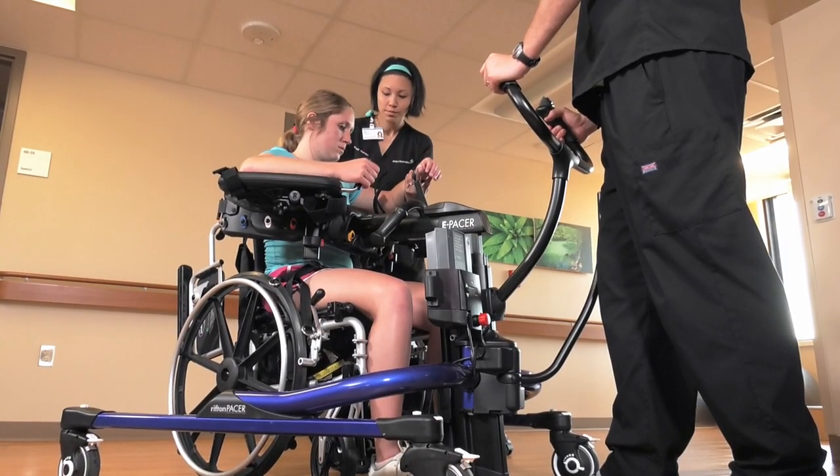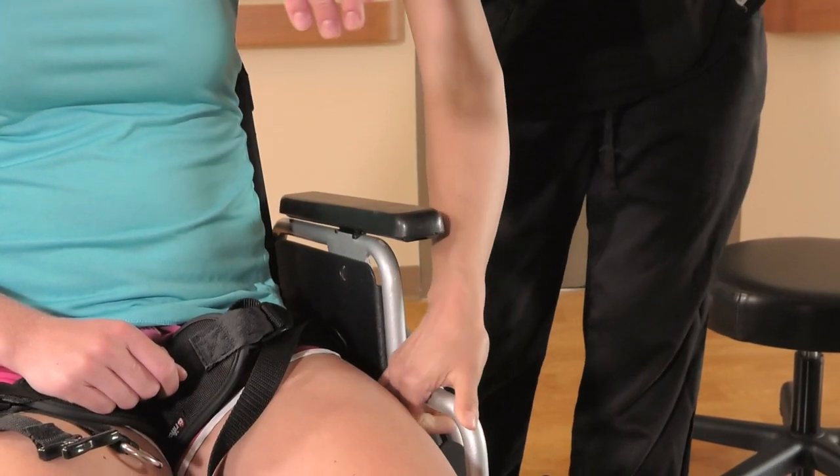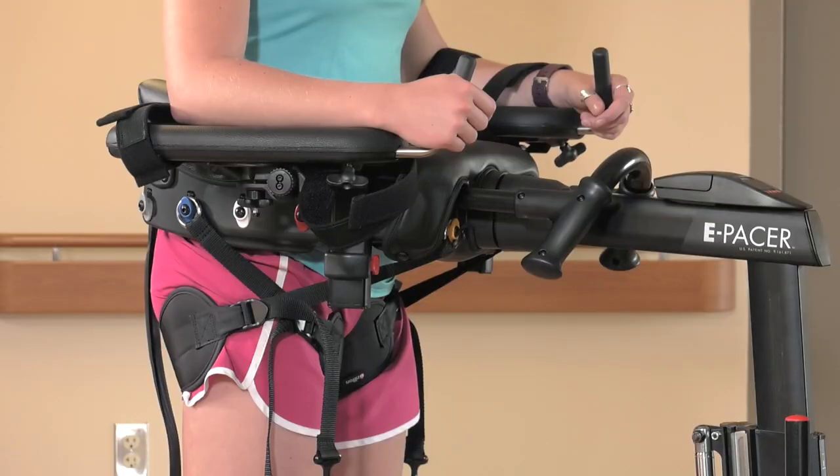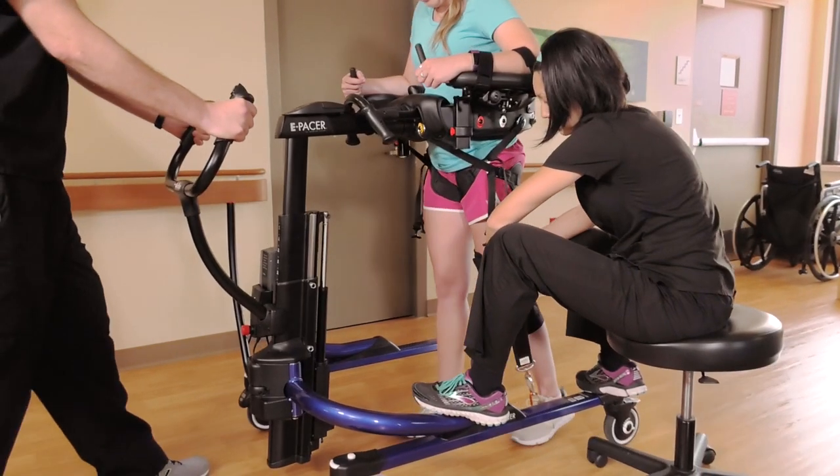Move the E-pacer away from the patient and return the wheelchair armrests to their locked position. Once a patient is able to stand for five minutes at a time in an upright posture without excessive fatigue, she may be ready to transition to gait training.